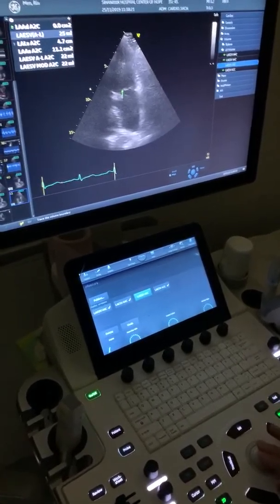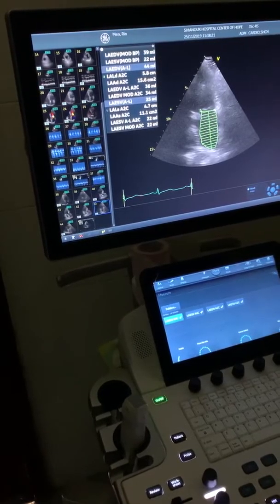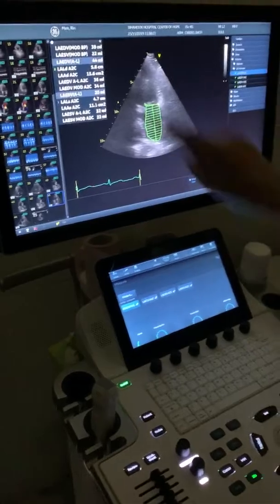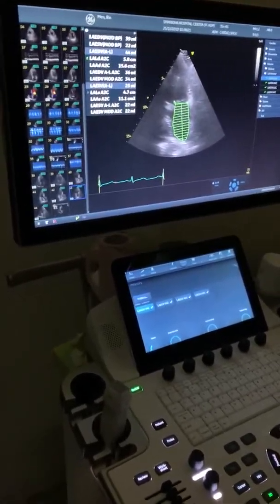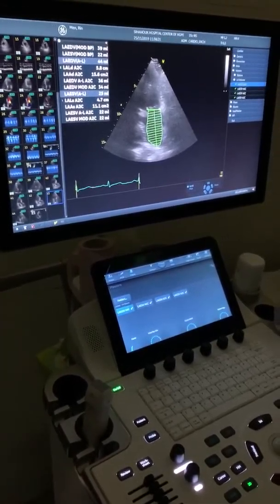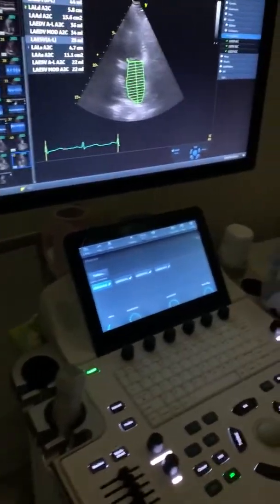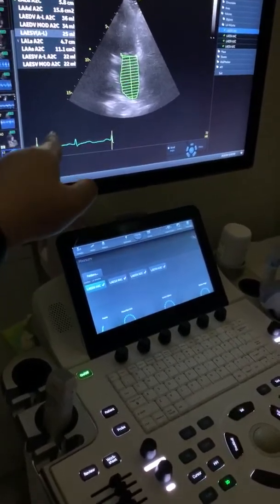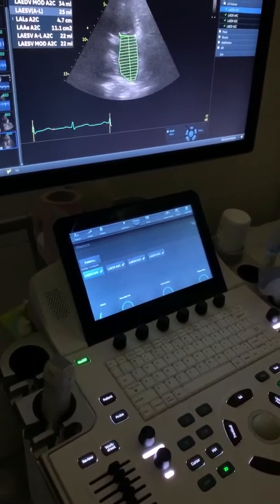So I think it's better to be consistent: diastole and then go to systole. As long as you know your ECG, because now we are in systole. That's why. Yep. Set. Good. Now you see it goes automatically to scroll. So move now your ECG in order for you to see your diastole. Move more. Either you go select here, doctor.